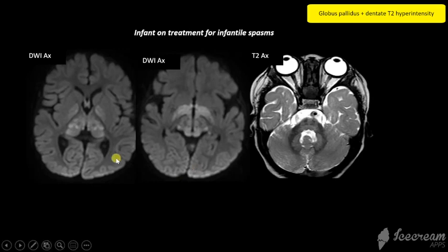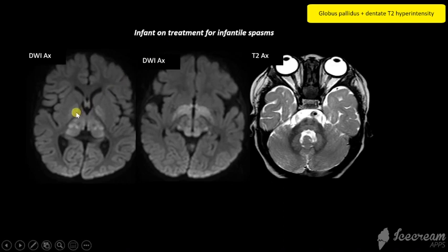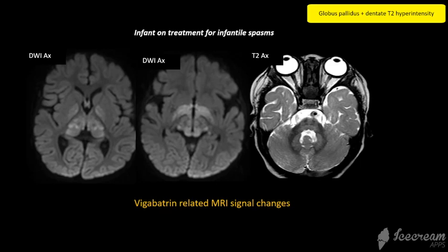In this classic case, history is very important. This child is on treatment for infantile spasms and has symmetric changes in the globus pallidus, thalami, subthalamic nuclei, brainstem, and dentate nuclei. These are characteristic vigabatrin-related MRI signal changes. It is important to be aware of this so as not to misdiagnose this as a metabolic or mitochondrial etiology.